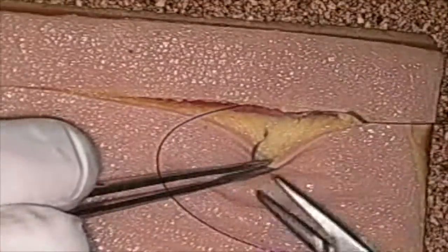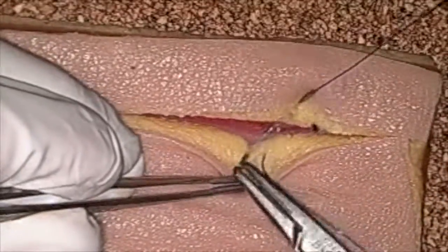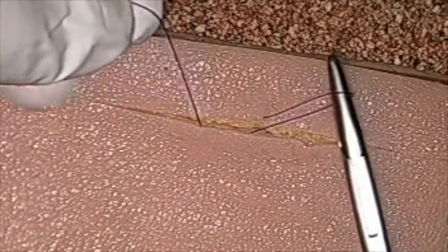That finishing knot is actually a fairly weak knot because there's a loop in it, so you have to do two more than the starting knot. As you can see here, I'm doing vertical bites resembling the linea. These bites are evenly spaced apart, putting nice tension on the tissue. I'm not grabbing the tissue too hard, and it allows me to set up a good finishing knot.